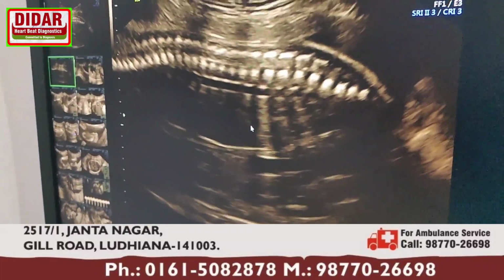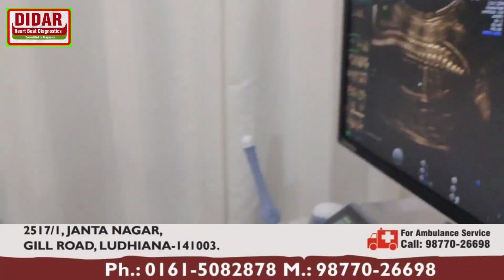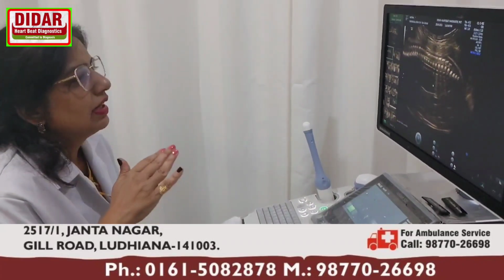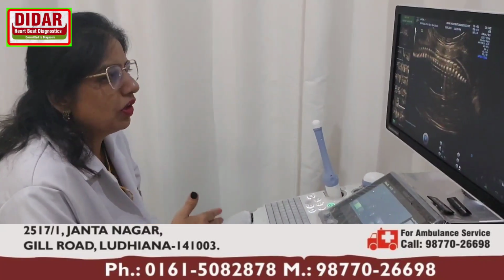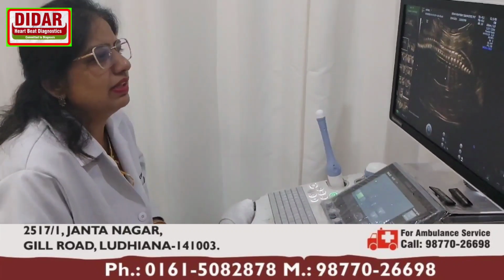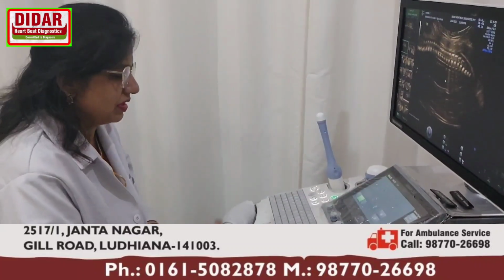Now I will explain what we see in a level 2 scan. A level 2 scan basically means we have to check all parts of the fetus, like fetal head, backbone, spine, then chest, abdomen, limbs, hands, feet. So we see all parts in detail. Whatever part we see first, then we keep on taking pictures.